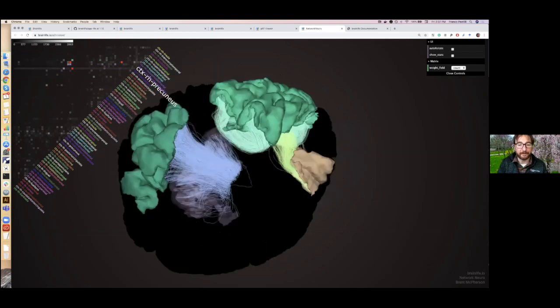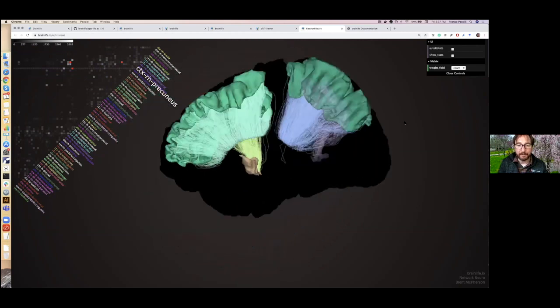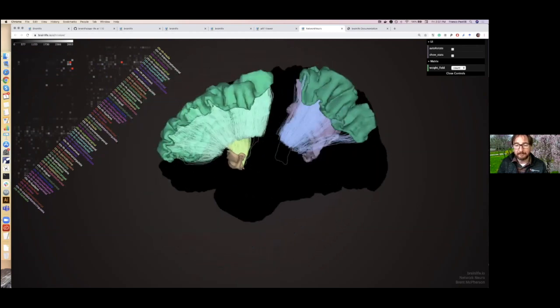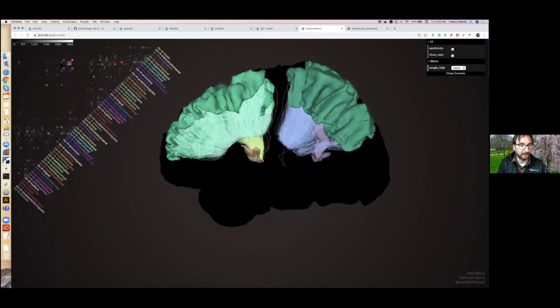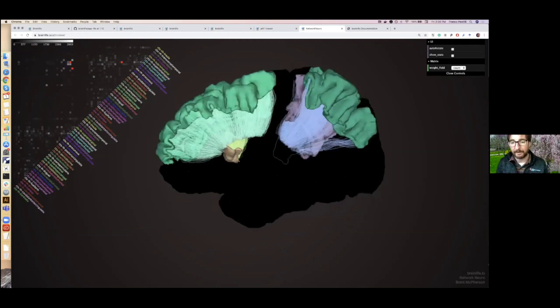You can see different, and I find this very important, you can see sometimes that some of the connections might be anatomically not correct, and I might not want to use them for my counts and my statistics on the network. So I like to go back, and there's a mechanism to clean these anatomical structures so that you don't build matrices that contain these artifacts. For example, this streamline is extremely different from the rest of the group of streamlines.